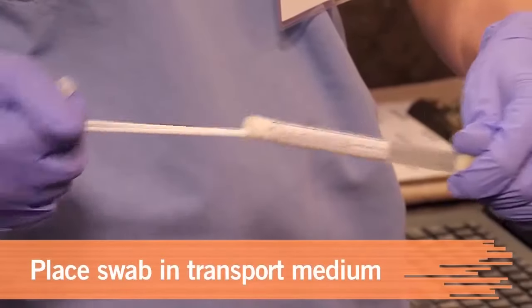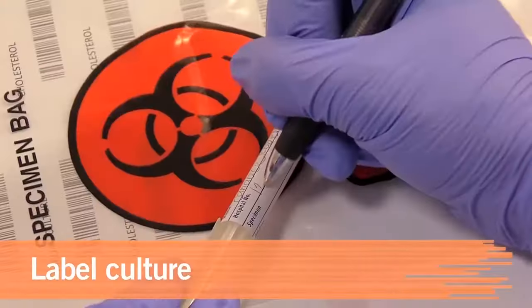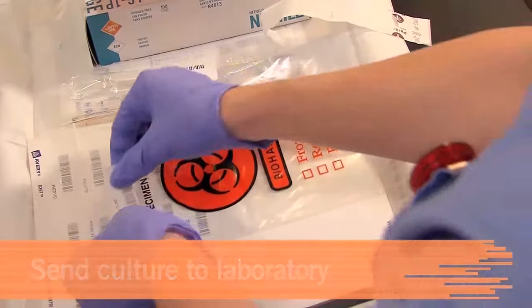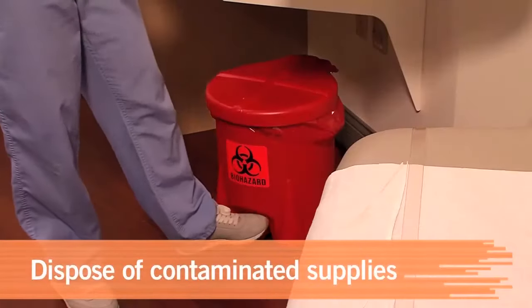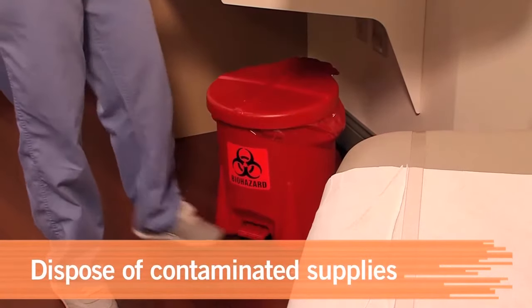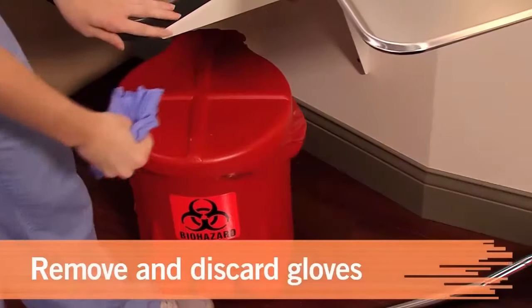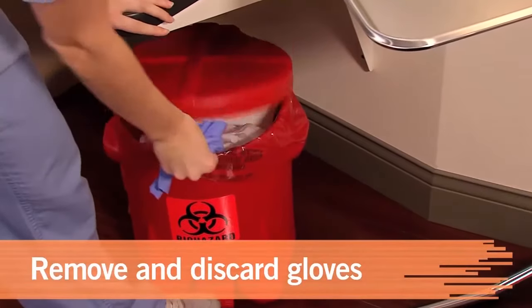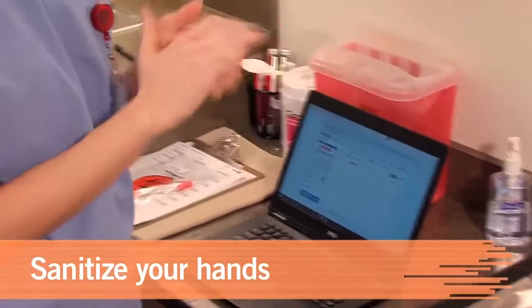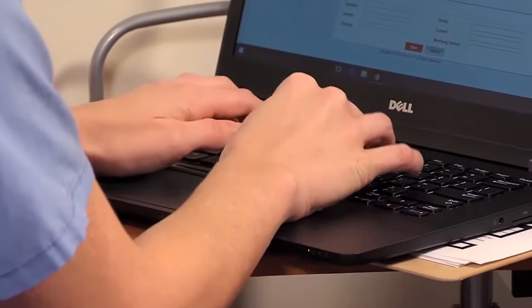Place the swab securely in the transport medium and label the specimen right away. It's now ready to send for testing. Dispose of your contaminated supplies in a biohazard waste container. Disinfect your work area, then remove and dispose of your gloves and sanitize your hands. Remember to document the procedure in your patient's health record.